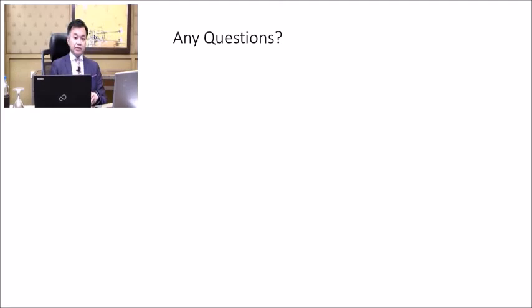Would I recommend Symphony to one-eyed patients? I have used the Symphony lens in one-eyed patients, and they've had very, very good results. It is a long consultation process, and I tend to discourage them from having a premium IOL, if at all. But I have had several patients who, despite that, wanted to have it done, and I have done that, and the results have been good. They've had extremely good visual performance for distance, intermediate, and near. I would only use the Symphony lens as a premium lens in this category of patients, as opposed to a bifocal or trifocal lens.